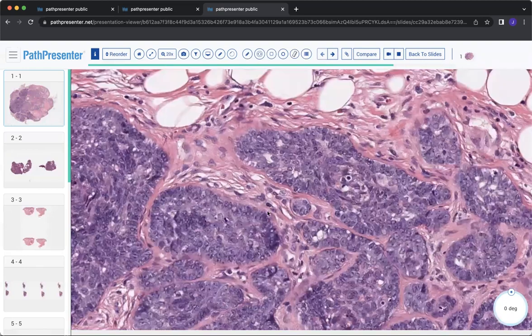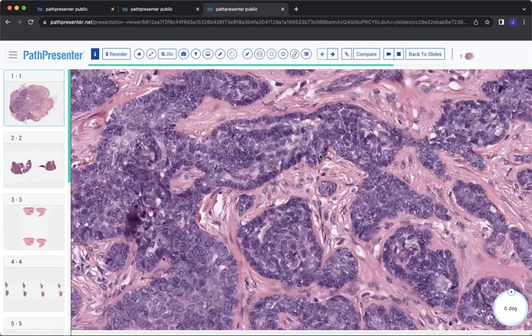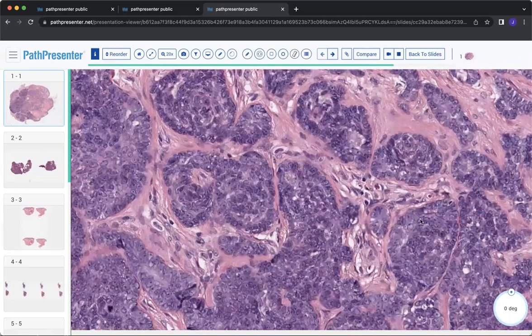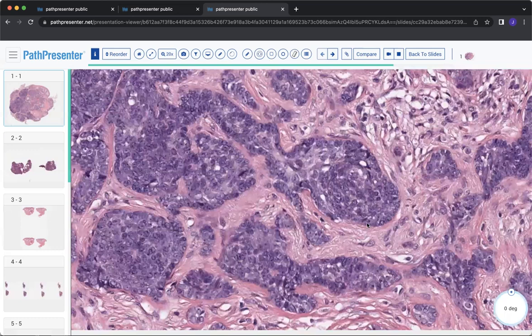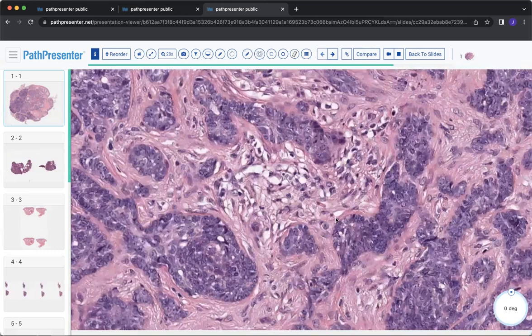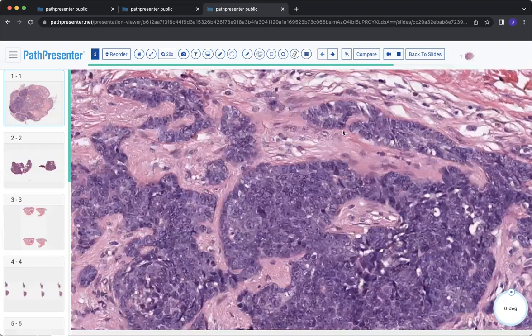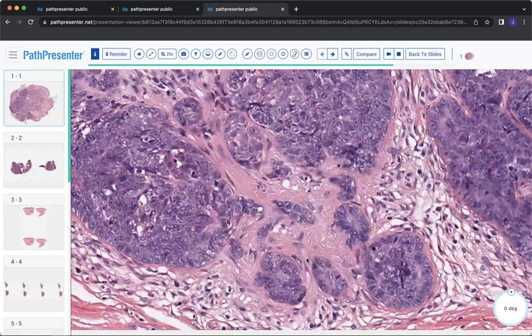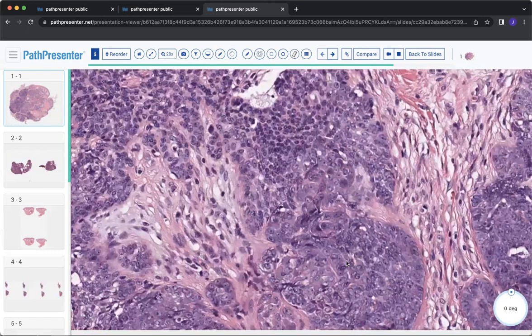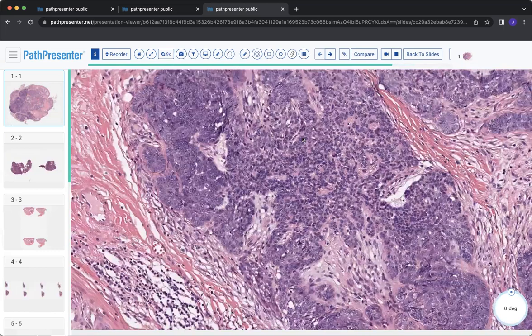The other thing is I've noticed when I look at different examples of basal cell versus trichoblastoma is that the trichoblastoma itself, the cells are actually quite homogeneous. You don't see a ton of pleomorphism. You don't see a lot of mitotic figures. Remember, a basal cell is the malignant form of a trichoblastoma or trichoepithelioma. So in a basal cell, you are going to see a lot more cellular misbehavior, whereas here, you're not really seeing that atypia. These cells are pretty monotonous here. So that can really help as well.